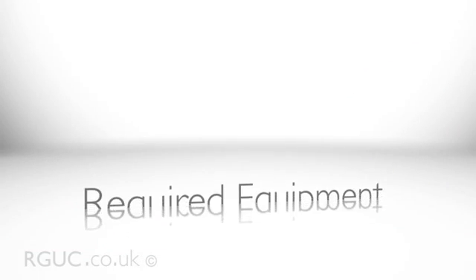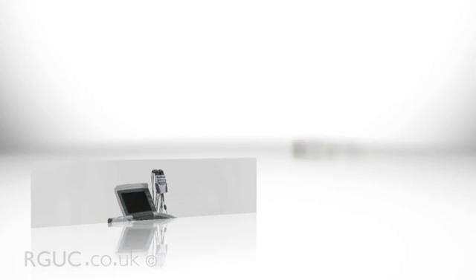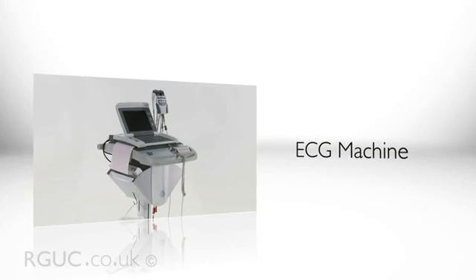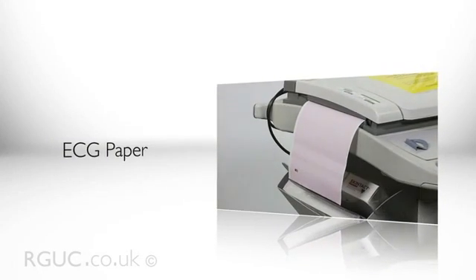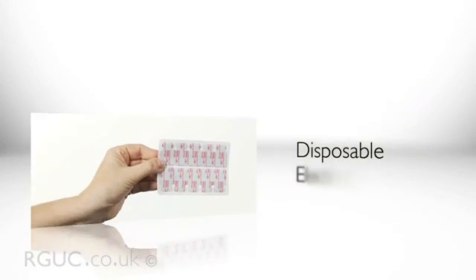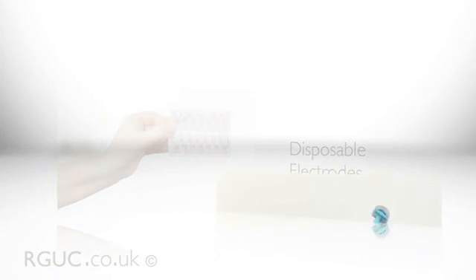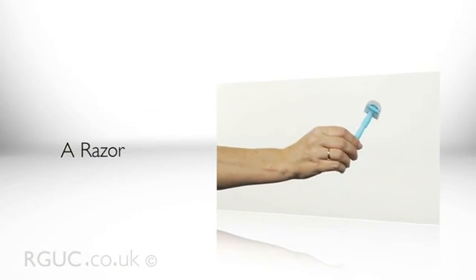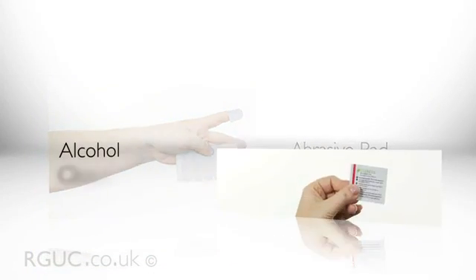To perform a resting 12-lead ECG, you will require the following equipment: an ECG machine, ECG paper, disposable silver-silver chloride tab electrodes, a razor, an abrasive preparation pad, and an alcohol-based cleansing wipe.